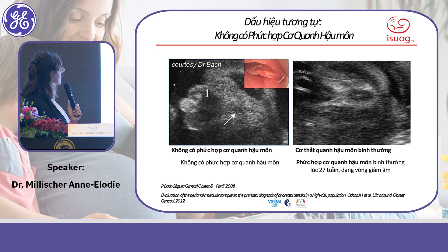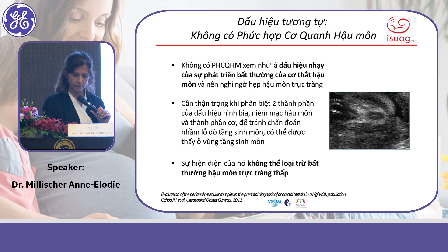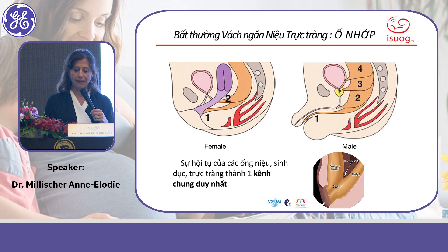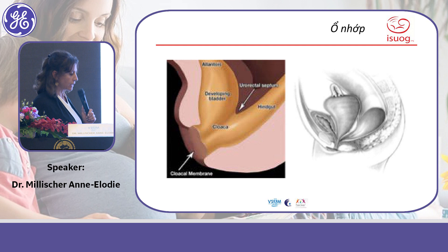Here is an example of absence of the perianal muscular complex — you no longer see the hypoechoic ring surrounding the hyperechoic central area. This case has no anal sphincter muscle. In front of this anomaly you can suspect anorectal malformation, and the worst form is the cloaca.